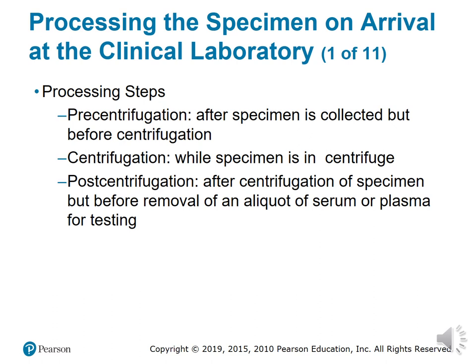So, during the process of centrifugation is when it's doing its thing. It's separating the whole blood or the other cells that are not needed. And if it's an SST tube, I'm separating the whole cells from my serum and I'm collecting my serum that is going to be separated by the polymer that's at the bottom of the tube before you spin it in the centrifuge. As you're spinning, and the circumference of the centrifuge is going round and round, slowly your polymer is popping up. Your whole cell blood count is going down and your serum is staying at the top.